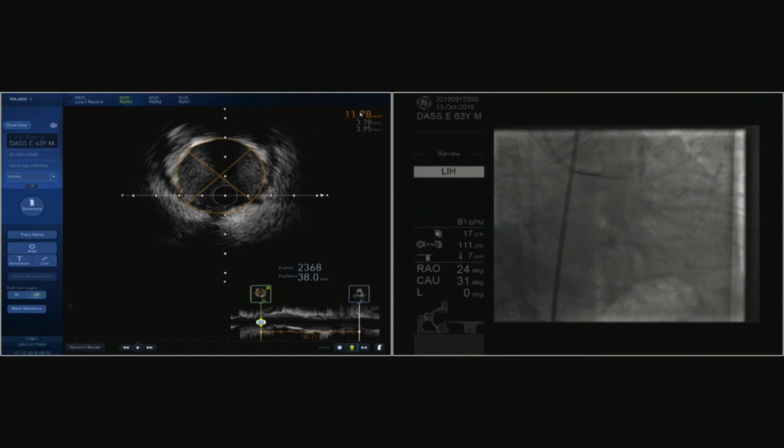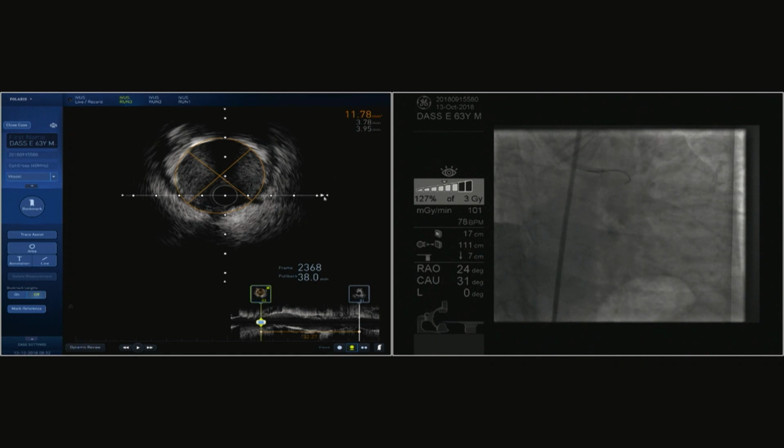So of course, comparing the original vessel size, you can go up a little bit more. For example, the 4.5 millimeter balloon dilatation will be acceptable. But this area is not so bad. But in my feeling, in my lab, probably I will go up a little bit more, a little bit higher pressure for 4.0, maybe nearly 20 atmospheres or something like that.